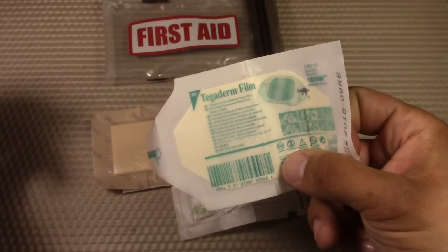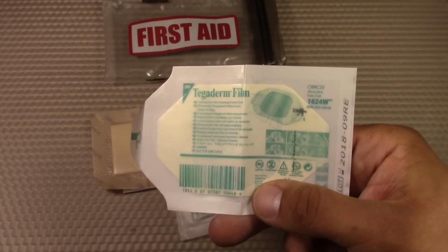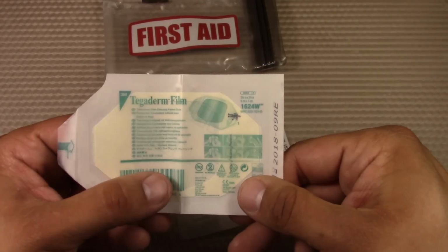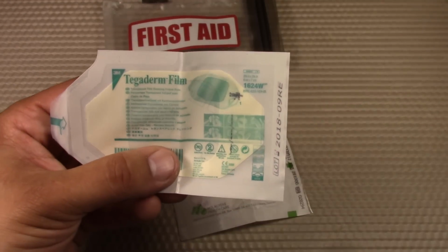Start going through some of those modern wound dressings, starting off first with the 3M Tegaderm film. So on the Mountain RN's videos, he talked about dressing your wound as you would dress yourself when going hiking outdoors, for example. So for your clothing, you would have usually a base layer, a thermal layer, and a shell layer. Well, that Tegaderm film kind of serves as the shell layer to a wound.